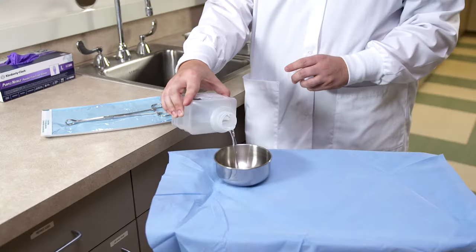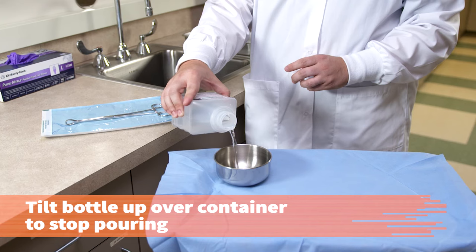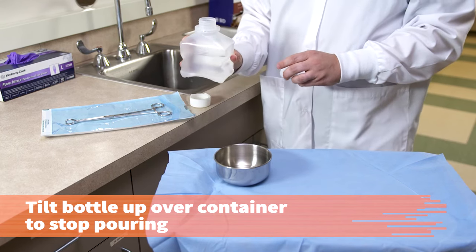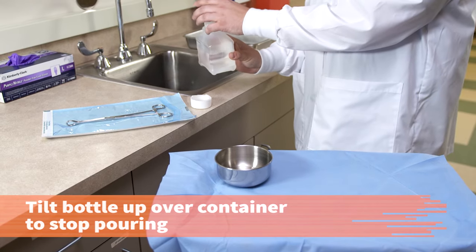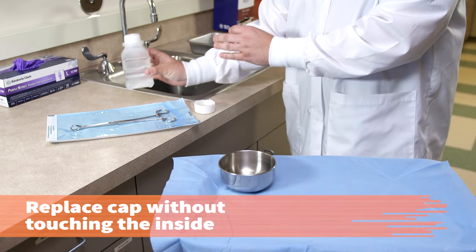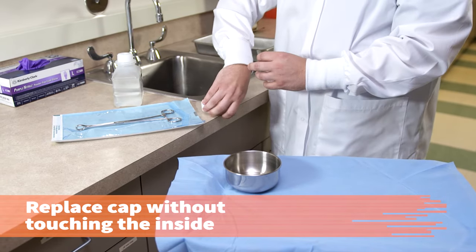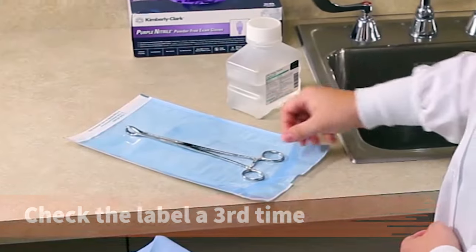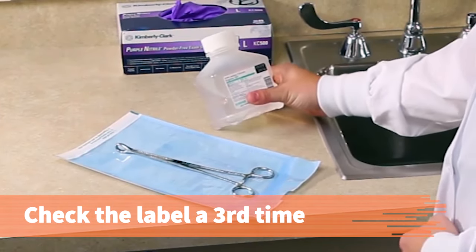Solutions spilled on the sterile field will contaminate the field, so tilt the bottle up to stop the pouring while it is still over the container. Being careful not to touch the internal surface of the lid, replace the cap or caps off to the side, away from the sterile field. Check the label again to make sure you poured the correct solution.